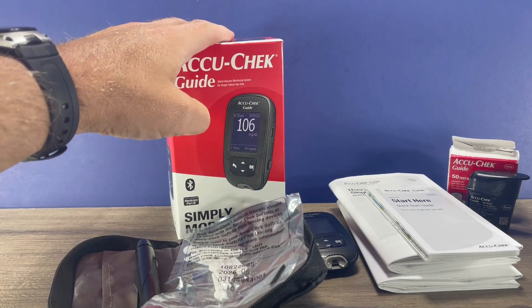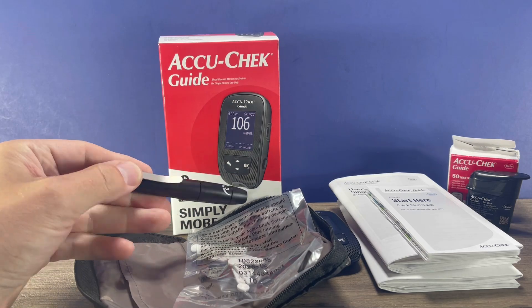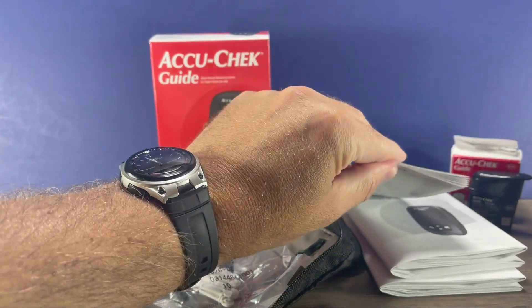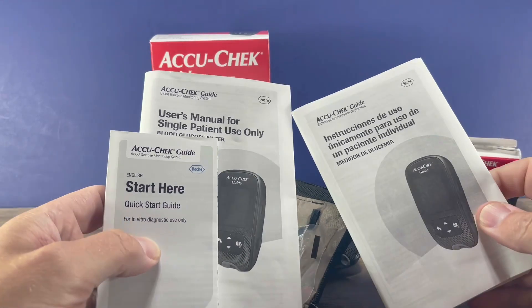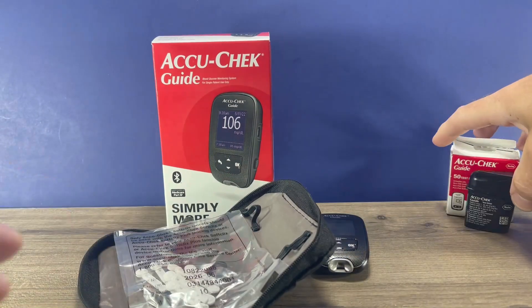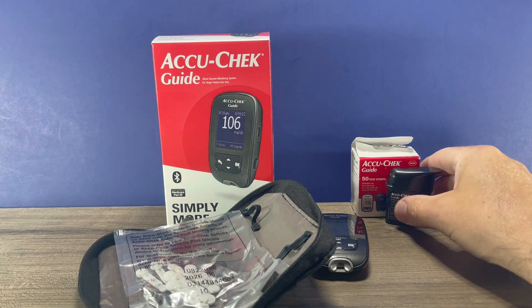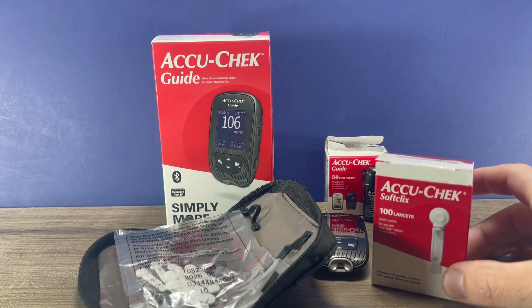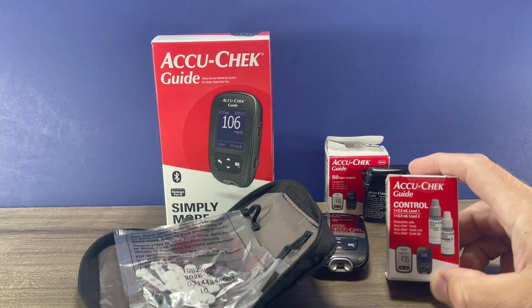Included in the box that I purchased, I got the carrying case, the lancing device, 10 lancets to get you started, a quick start guide, and two full complete user manuals in English and Spanish. In addition to testing, you'll need to buy some test strips to go with the meter — I'll include a link where you can get those or you can find them at your local pharmacy. You'll also eventually need more lancets and control solution, which I will show you how to use in a separate video.